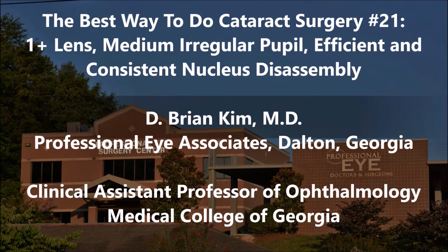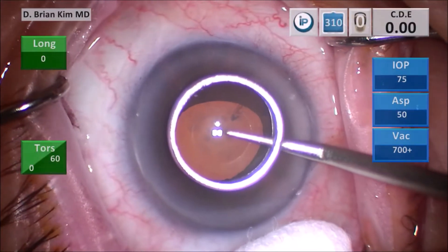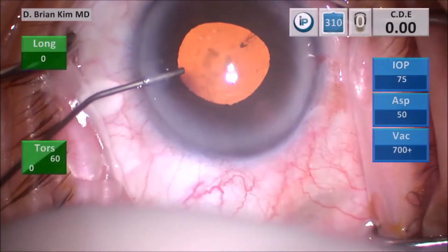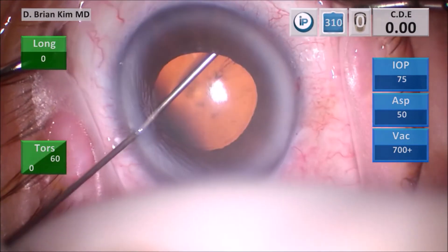Sometimes these softer lenses are difficult to prolapse out of the bag — you try to spin the lens and it's difficult to spin. So you're going to see a way to efficiently and consistently crush and disassemble the lens using mechanical fracturing. I use my corneal mark to help me center and size my rhexis, make my superior and inferior paracentesis incisions, and then inject intracameral lidocaine and epinephrine to help anesthetize and dilate the pupil.